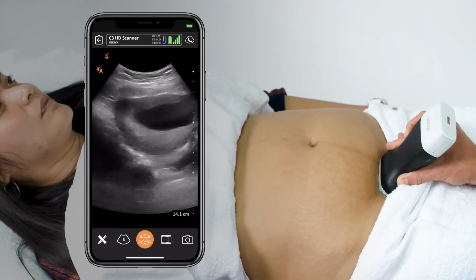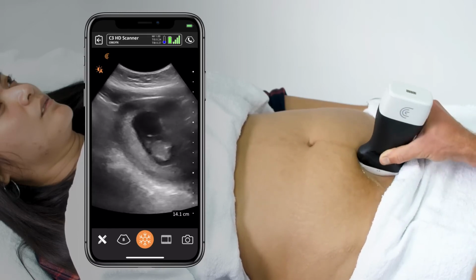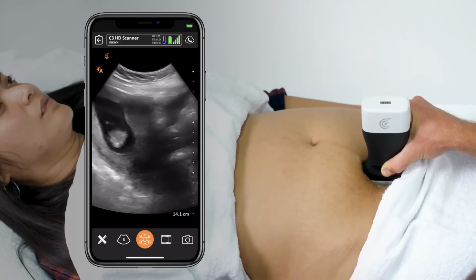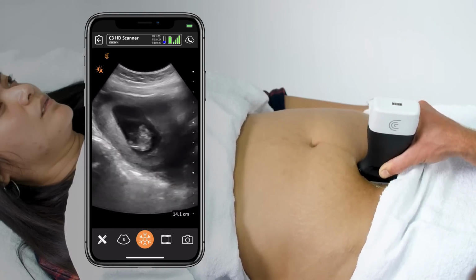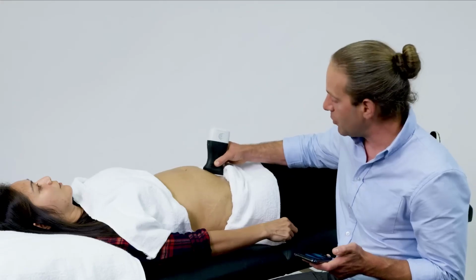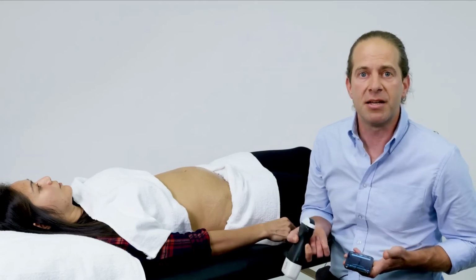Once I've scanned all the way through the uterus, it's always a good idea to do a second axis to go lateral, this time with the indicator to the patient's head, and do another sweep, just to make sure there's even no second gestational sac hanging around with twin B. And once I've swept through, I can feel confident that I've identified a positive intrauterine pregnancy in this patient.